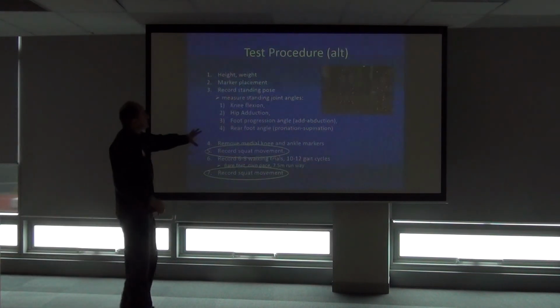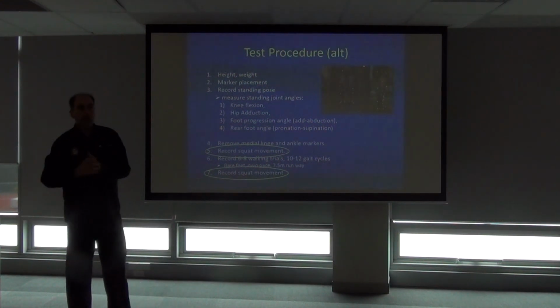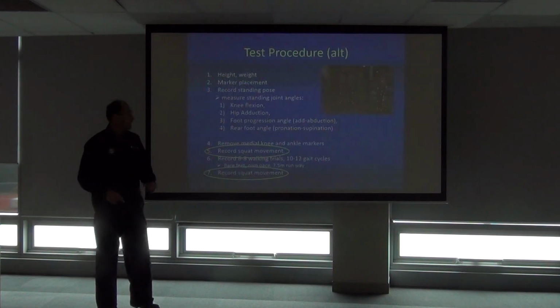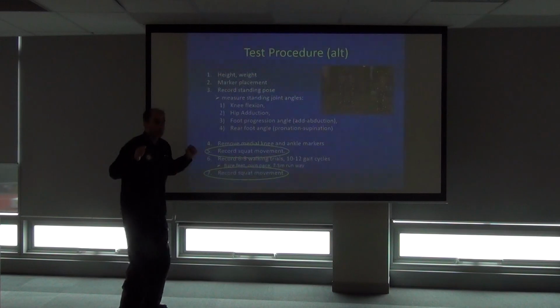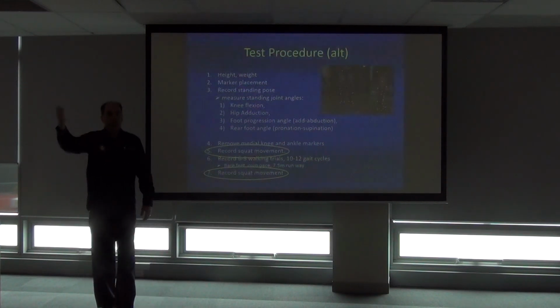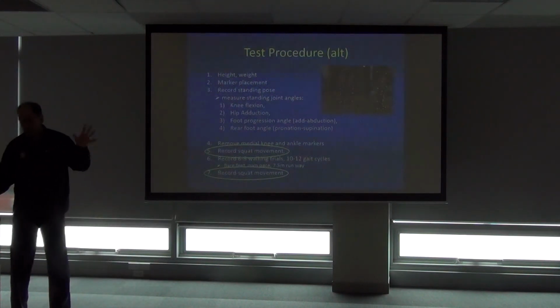I'm just going to add this because that was the way it was done in the reliability study. Since then, with the CPQs and various other things, I've introduced a squat movement before and after as well. You've still got everything else the same, but you've got a squat before, they do whatever they're going to do, and a little squat after they're finished. So a couple of things have been added in. They weren't part of the reliability study, but are things I've added since then: just a squat movement before and after whatever the movement trial is.